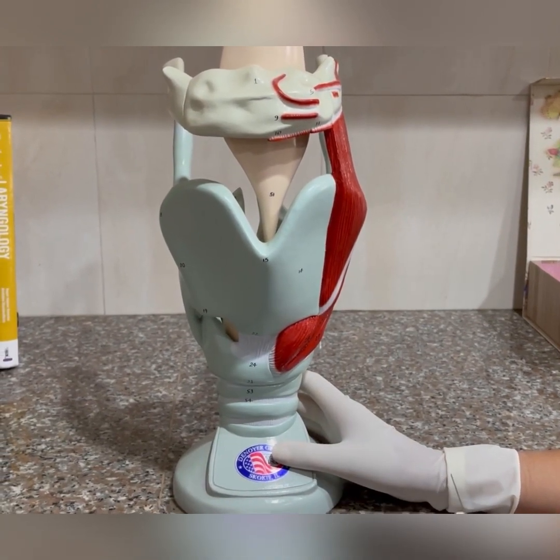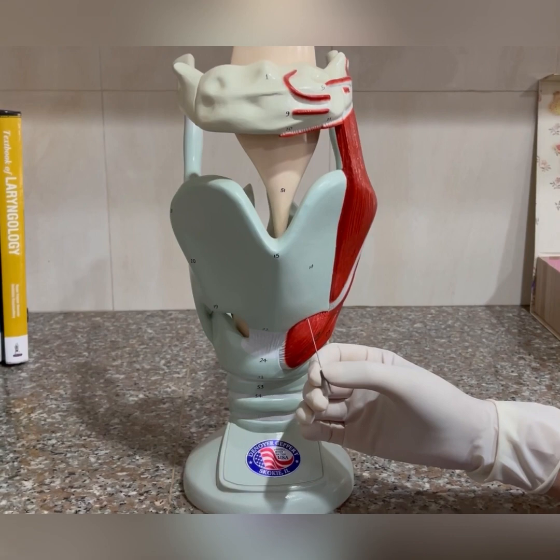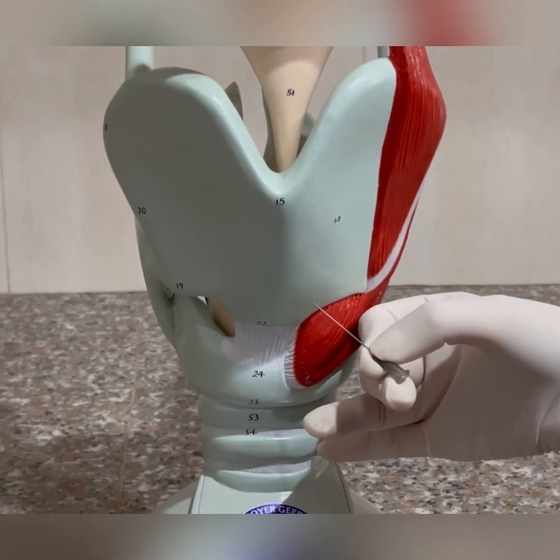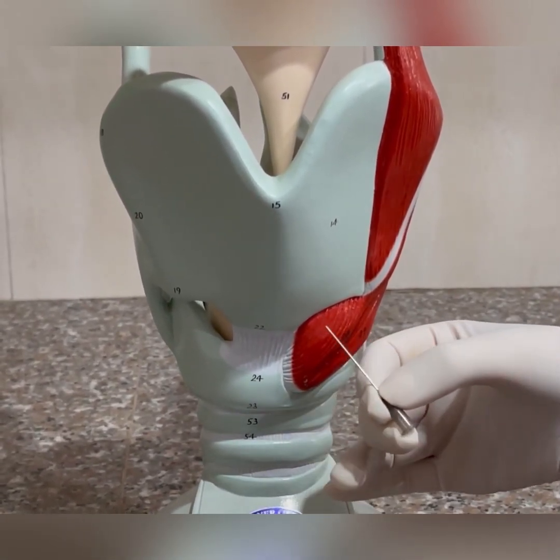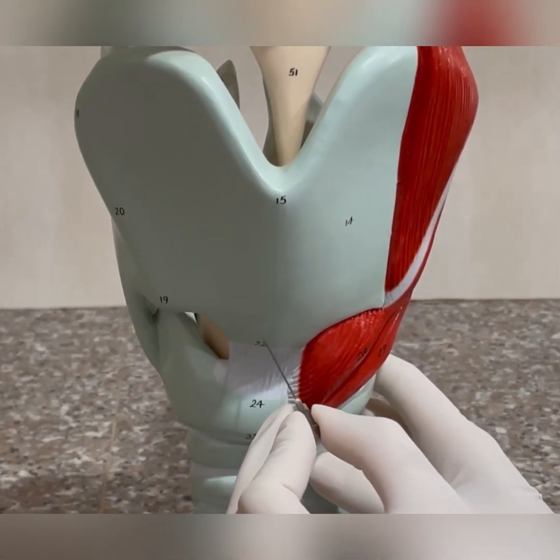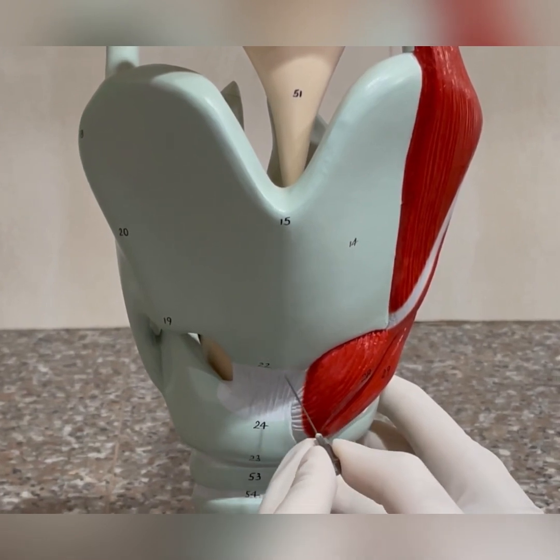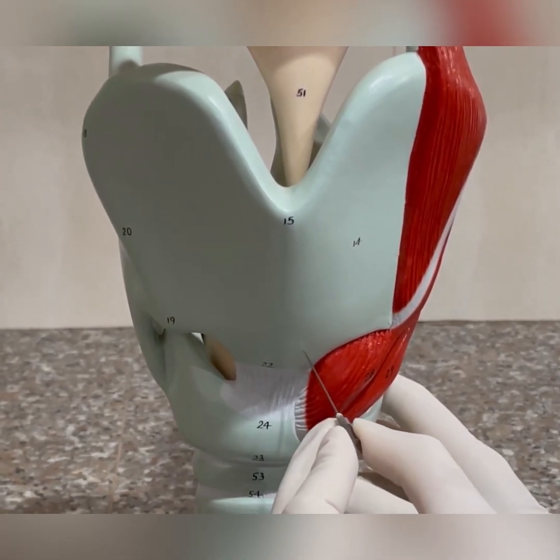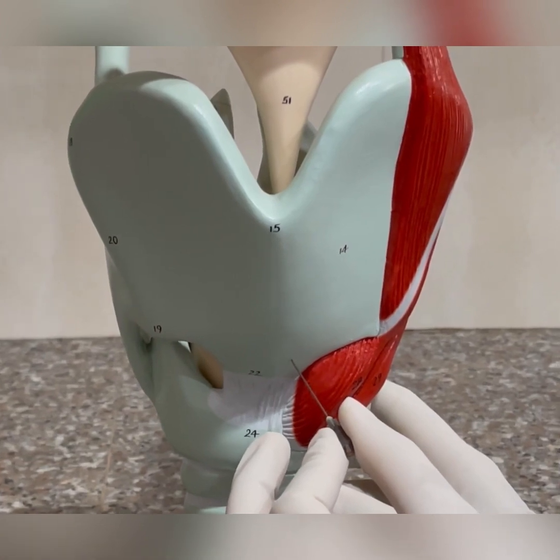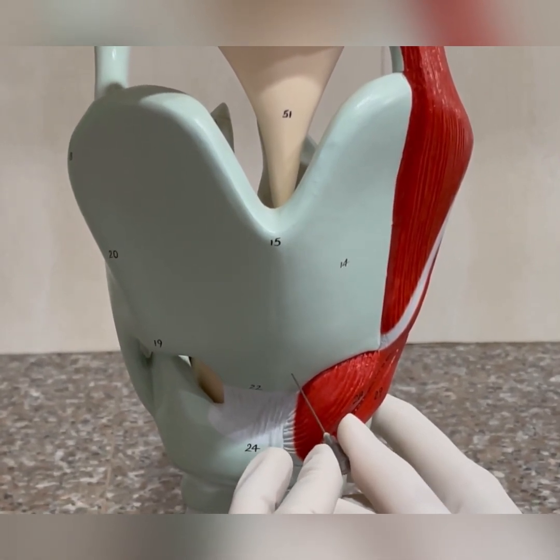I typically like to first try the trans-thyroid technique, for which I take a 20 or 21 gauge needle — a thick gauge needle. The idea is that when going through the thyroid cartilage, if the injection needle is very thin, the cartilage pieces may actually block it. For a left injection laryngoplasty, we go from the midline about five to six millimeters in a male, three to four millimeters in a female, and three millimeters above the lower border. At that point we use a boring action to go through both lamellae of the thyroid cartilage while the flexible laryngoscope is in, looking for tenting of the paraglottic space and vocal fold.